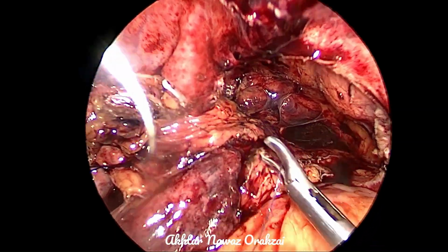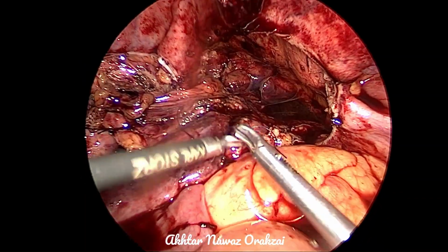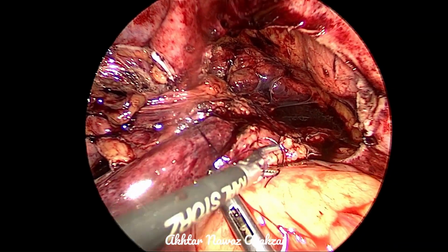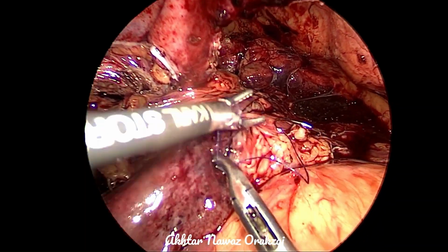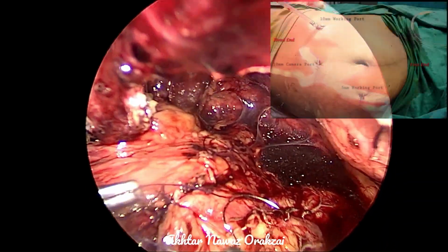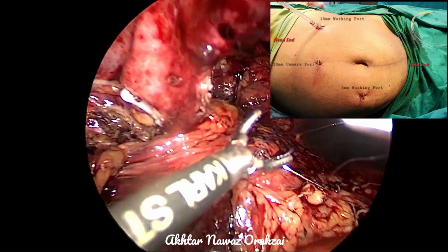So after this suture, some irrigation and suction is performed. And the area is cleaned, and then a drain is placed transperitoneally in one of the port sites, and then the procedure will be completed.